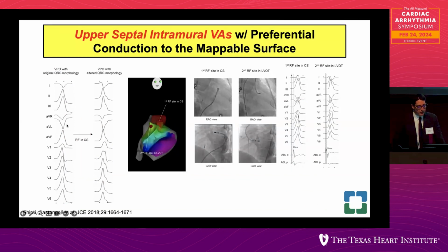The first PVC was ablated and it was earliest within the distal coronary sinus. So here we're talking about LV summit really, but still intramural. And you have recurrence with a shift in QRS morphology. It becomes more right bundle and more lateral. And then remapping showed a second early site underneath the coronary cusp region. So again, whenever you see a shift in morphology, instead of reapplying at the same site, which is quite intuitive, remapping always helps in these particular cases.